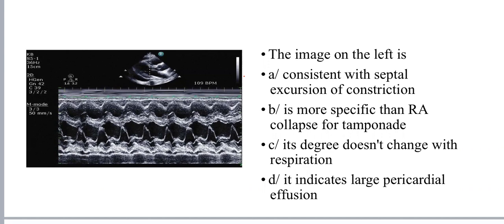So, which one do you take? A. You think this is constriction? Yes, there is early diastolic notching of the septum. Okay. Early diastolic notching of the septum.